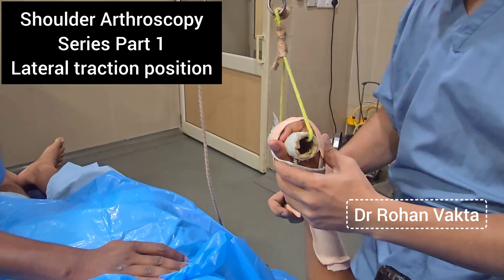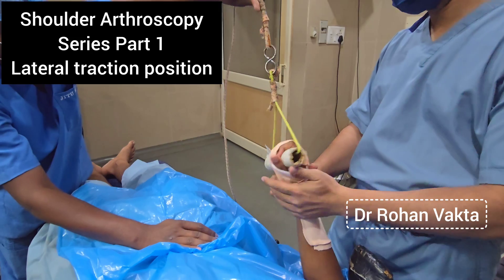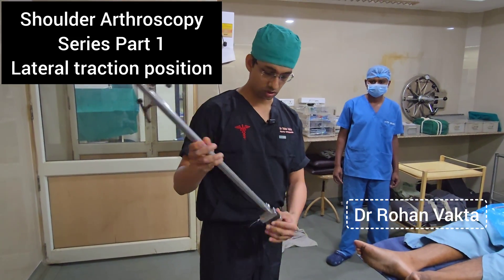After attaching the hand, we will show you how to use the traction. The traction device we have is not a very fancy one — it is locally made, a custom-made local traction device.